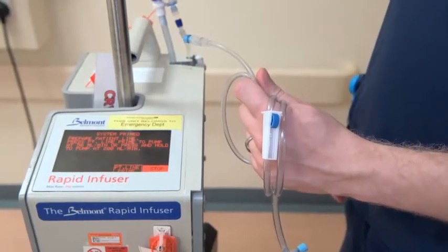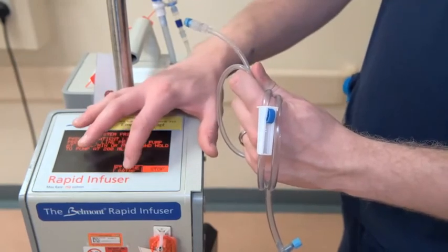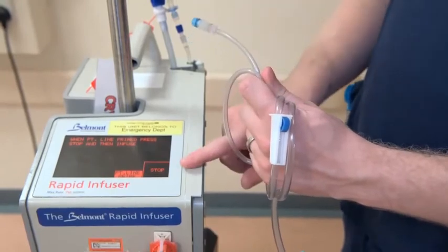Once the cassette has primed, you now need to prime the patient line. Just press the patient line prime and it will prime the line nicely for you. Once it gets to the end, you'll just need to press stop.